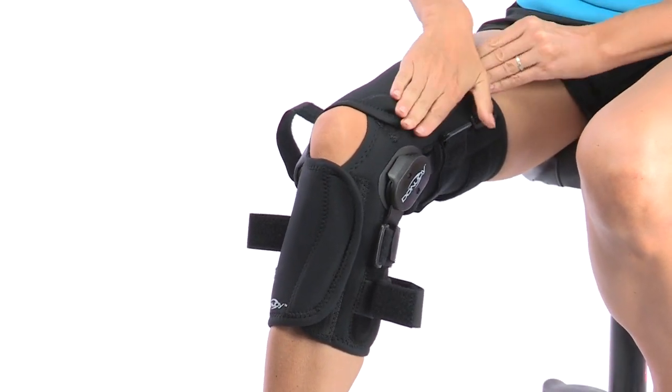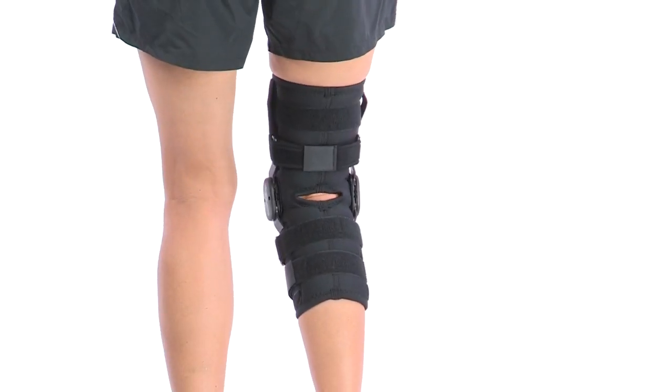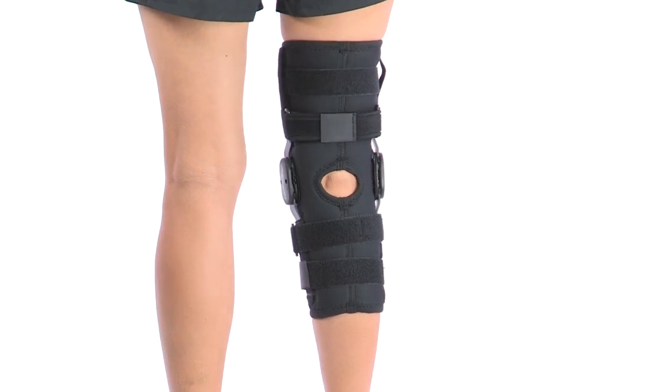The brace features versatile strapping for various knee ligament injuries. The popliteal cutout provides an open back option for extra comfort and breathability behind the knee.